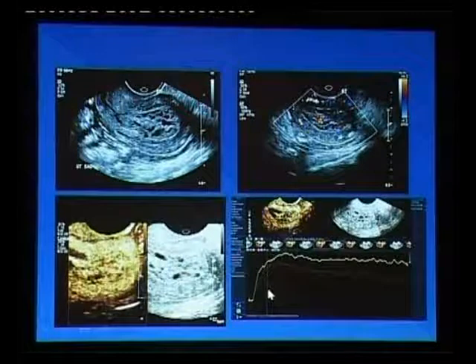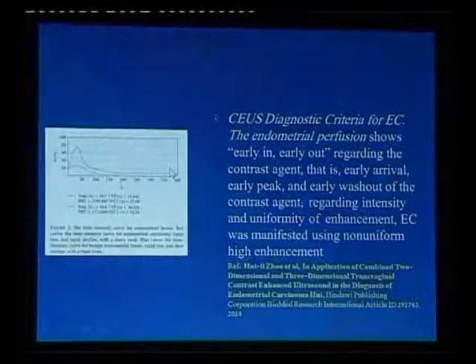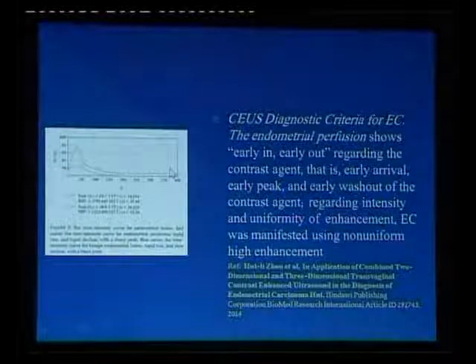That's a yellow dot there, and much more as compared to the myometrium. So this is another study which was published, I think, in 2014, but it's a very large series.